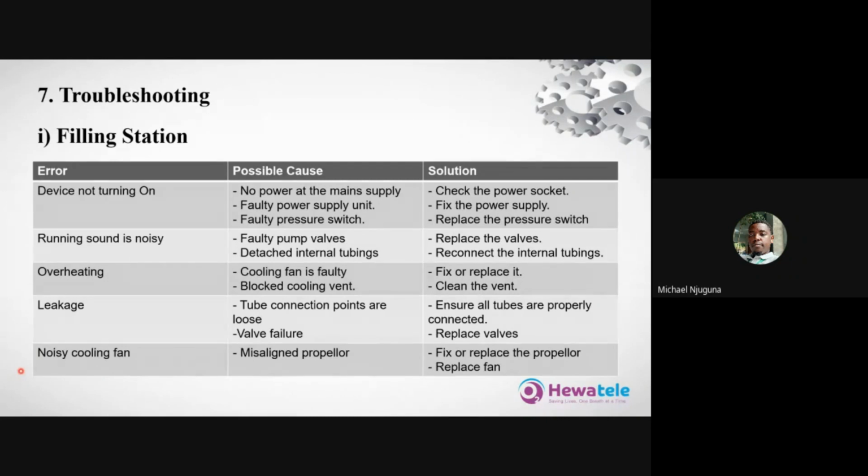So, troubleshooting. There are some common errors that you might witness while using LPR systems, and this is not only unique to this brand. Some of the common errors in the filling station are, as you can see on the slides, the device might not turn on.